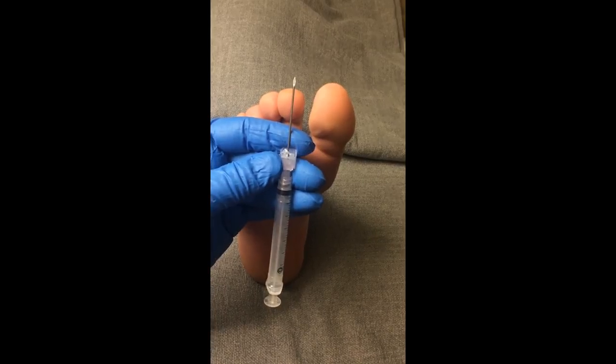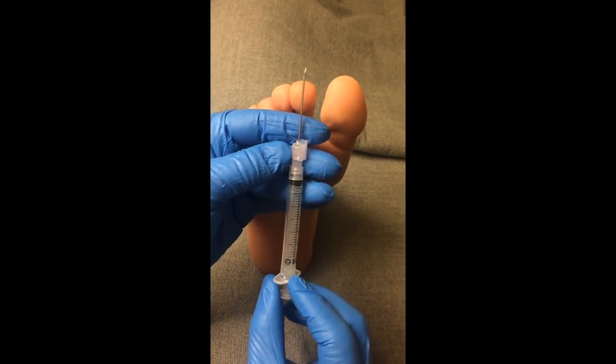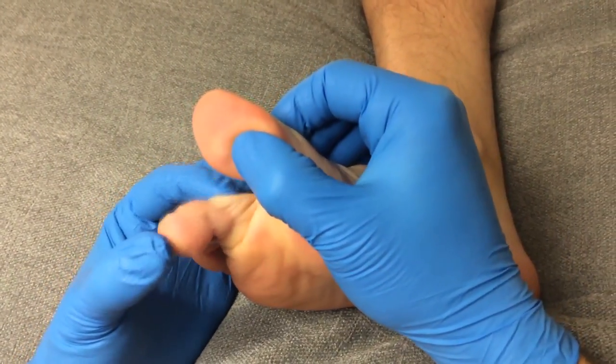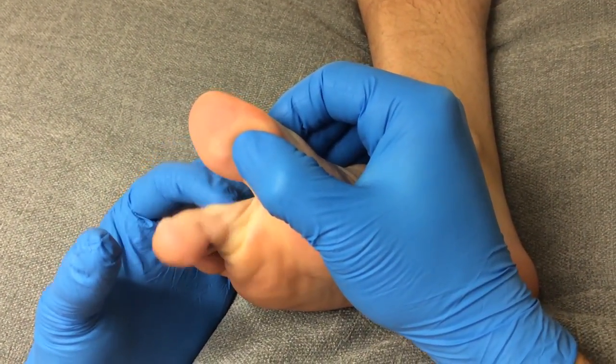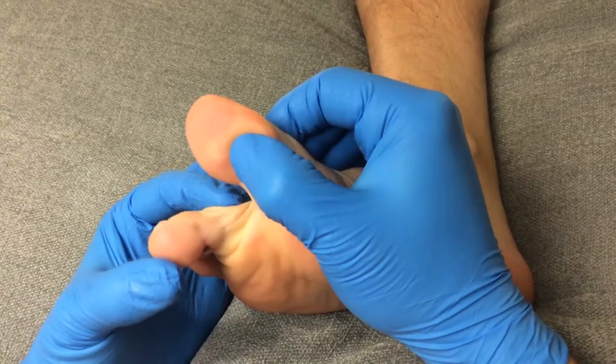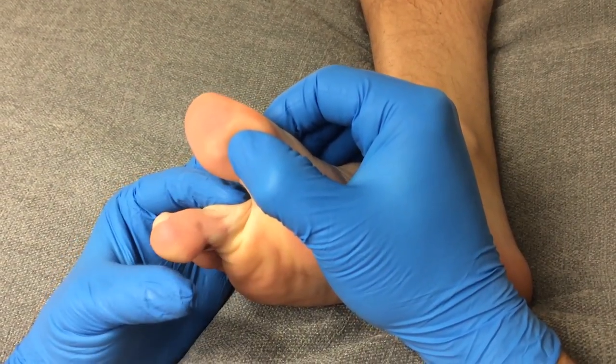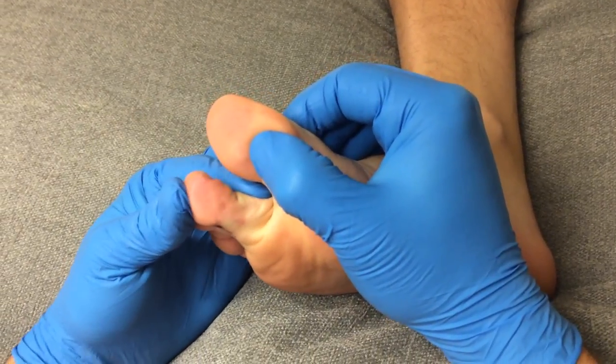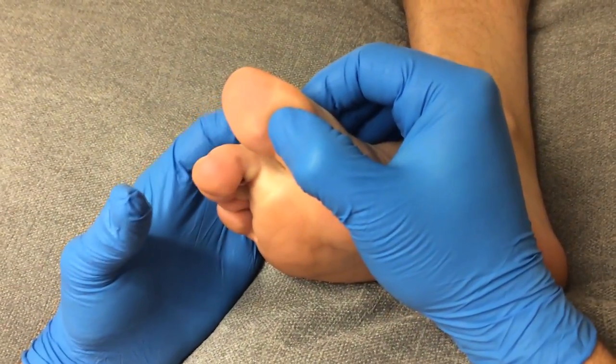The benefits of the beveled tip offer a sharp edge to transect the tendon fibers. We simulate this procedure with an off-weight bearing examination of the digit for flexible contracture at the metatarsophalangeal and the interphalangeal joints within the toe. If reducible and isolated to flexor contracture, this makes an excellent stand-alone or conjunctive corrective procedure.